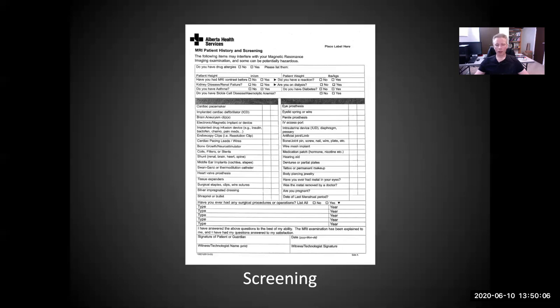Various kinds of pins that are in the body for a purpose such as repairing a knee are acceptable when we're doing a brain scan. However, it should be known that it's MR safe, and I would, generally speaking, ask a technologist about those particular items, but I can tell you that it is very likely that the person would be able to go into the scanner as long as it's below the neck.